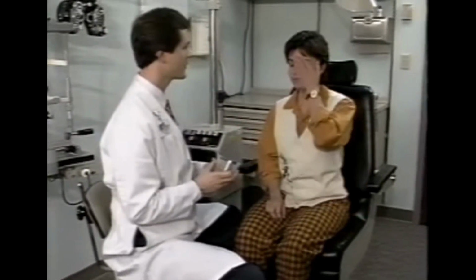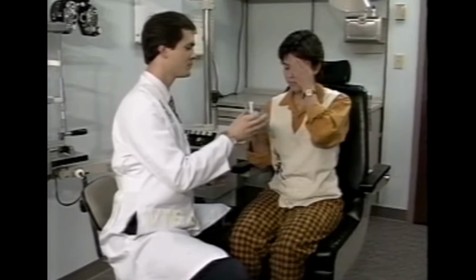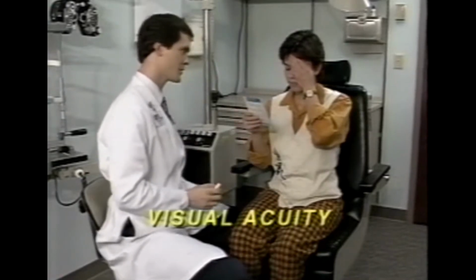Now I'll do the exam in sequence. All you need is your near card, a pen light, and your direct ophthalmoscope. Let's check your vision first. Cover your left eye with your hand. Hold this, please. What's the smallest line of numbers that you can read?